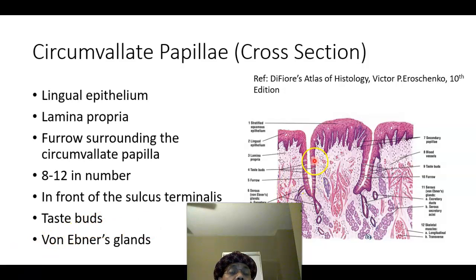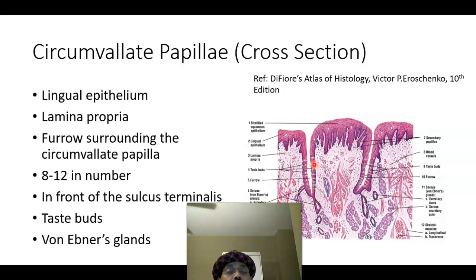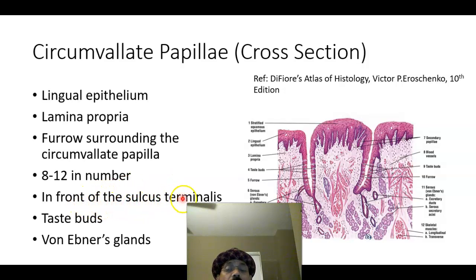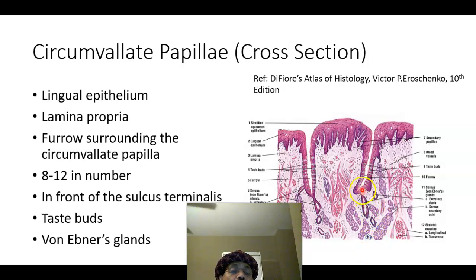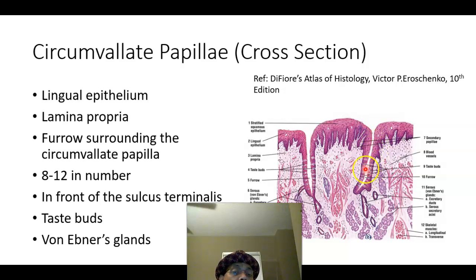Taste buds are present not only on the tongue — they are also present in the soft palate, the epiglottis, and even the upper one-third of the esophagus. We have 8 to 12 circumvallate papillae present in front of the sulcus terminalis, with numerous taste buds. There are glands in the lamina propria, and the gland duct opens at the base of the furrow of the circumvallate papillae. This is a serous secretion from the von Ebner's gland that dissolves food and keeps food in contact with the taste buds, and also washes out the food.